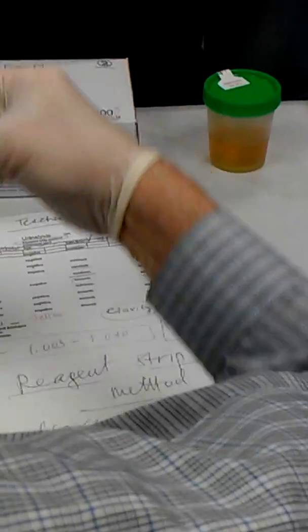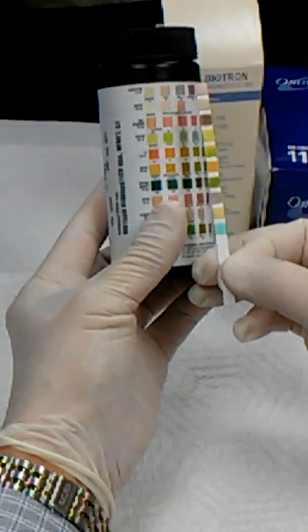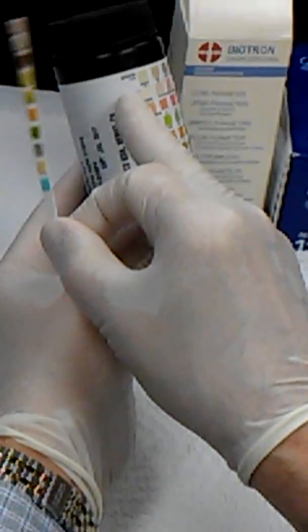And then 2 minutes are already gone. We have to do these things, right? So, first of all, because it was pink, I think it's negative. So you write negative. Then nitrites. Nitrites, of course, are negative too. You see this first color, right?